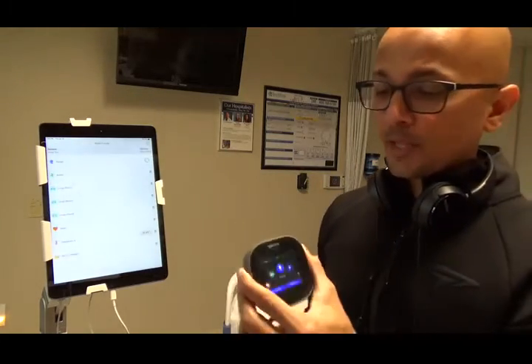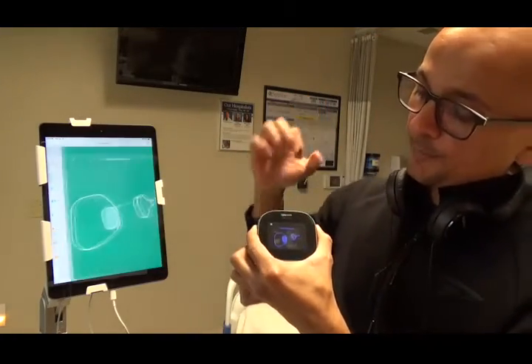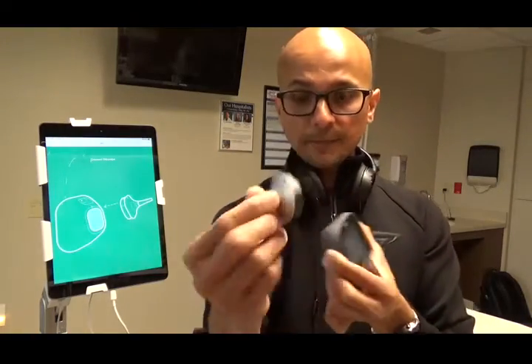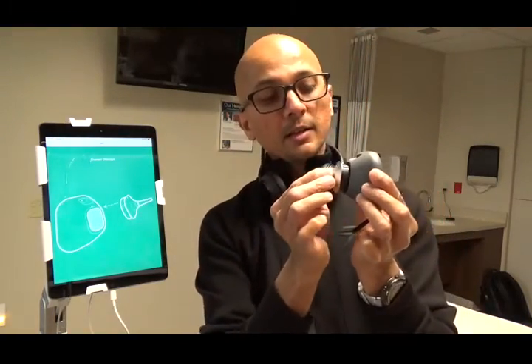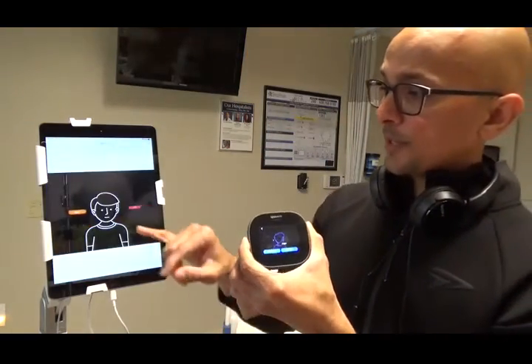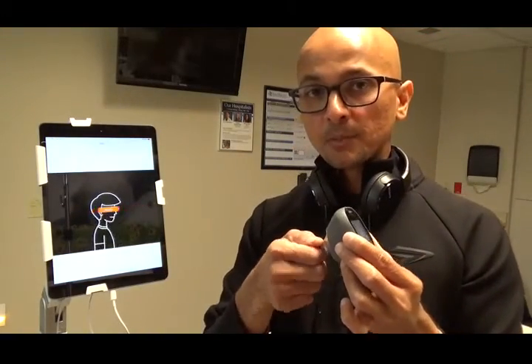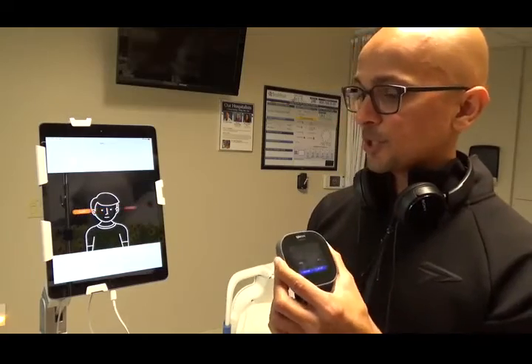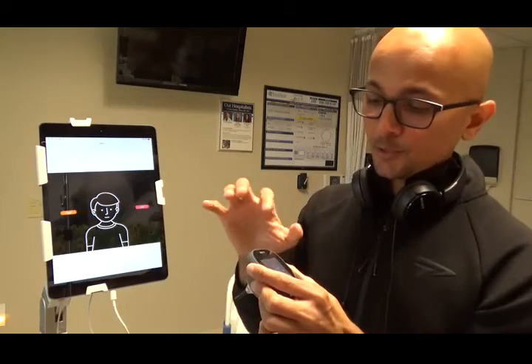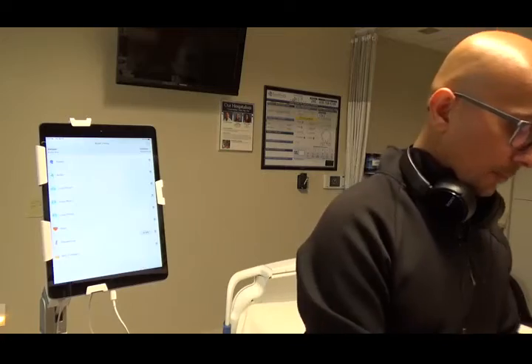And that's it. And if you were to do the otoscope, what ends up happening is you choose the ear, it's going to tell you, plug in the otoscope. Same thing, blue dot goes here. And then now it's going to ask you right or left ear. And there's another sleeve, by the way, that goes on top, right, from a hygiene perspective. And then you just get a view in each ear, and then once you're done, you go ahead and click done. Okay, obviously I'm not going to do that here right now, but you get the point.